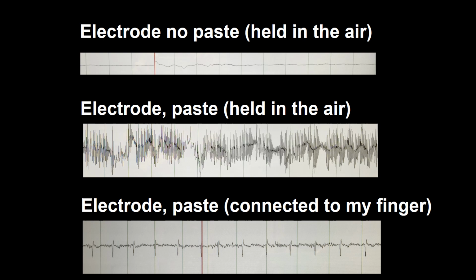This frame compares the recording in the same situation, except for no gel in the top tracing, gel on the middle tracing, and gel and human contact in the bottom tracing. It is from my own heart.